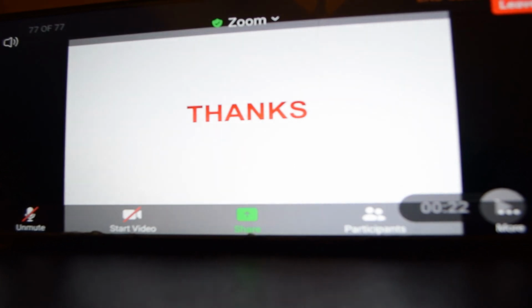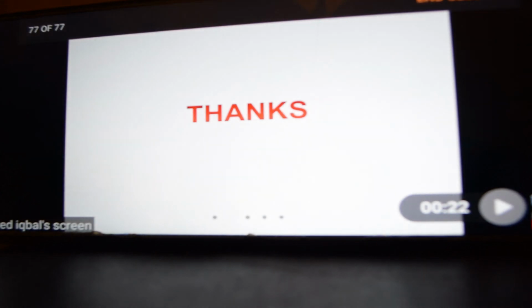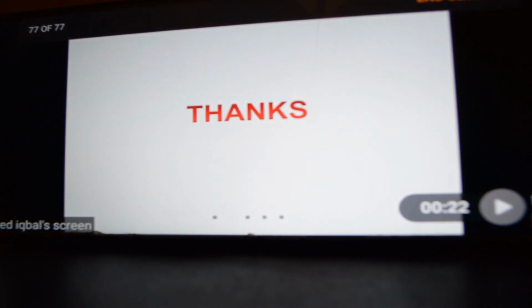So this was an overview of the HRCT, and hopefully you must have recalled all your clinical background to assess the disease. Before we say goodbye to each other, I let you know that distribution is very important for all these things.